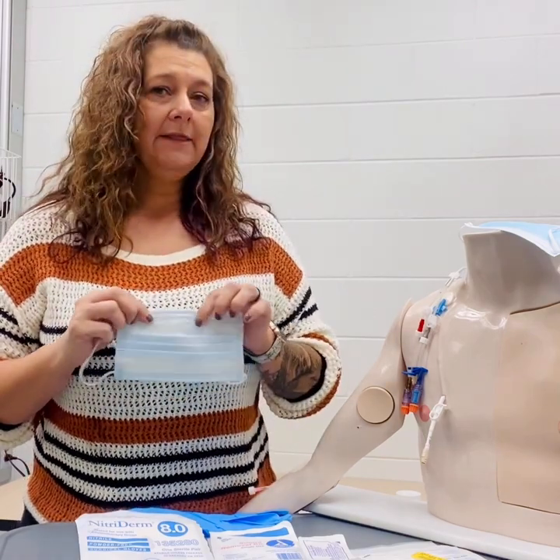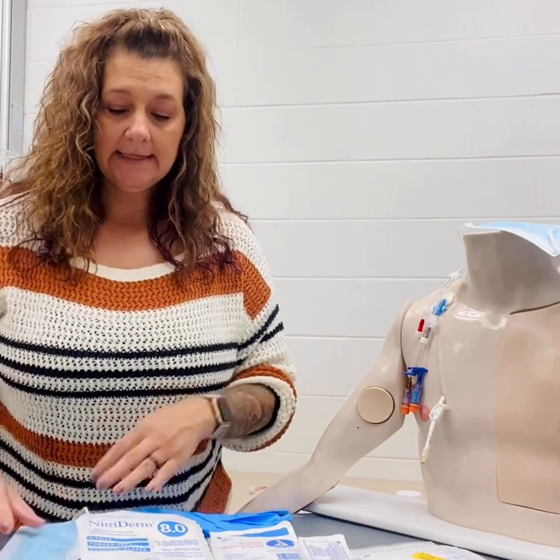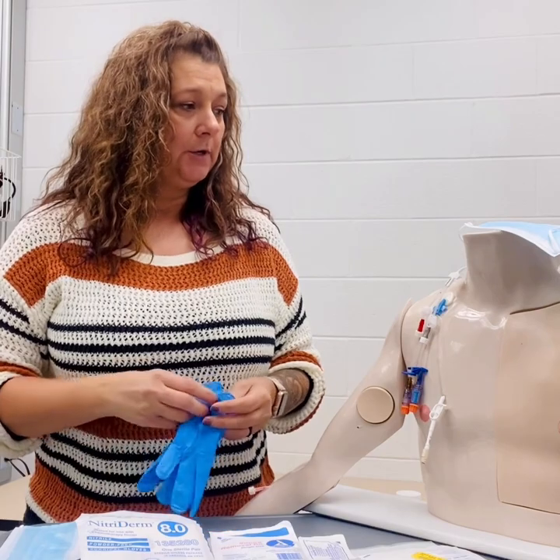We'll want to apply the mask to our patient and one to ourself. After we've done that, we would perform hand hygiene and put on our clean gloves.